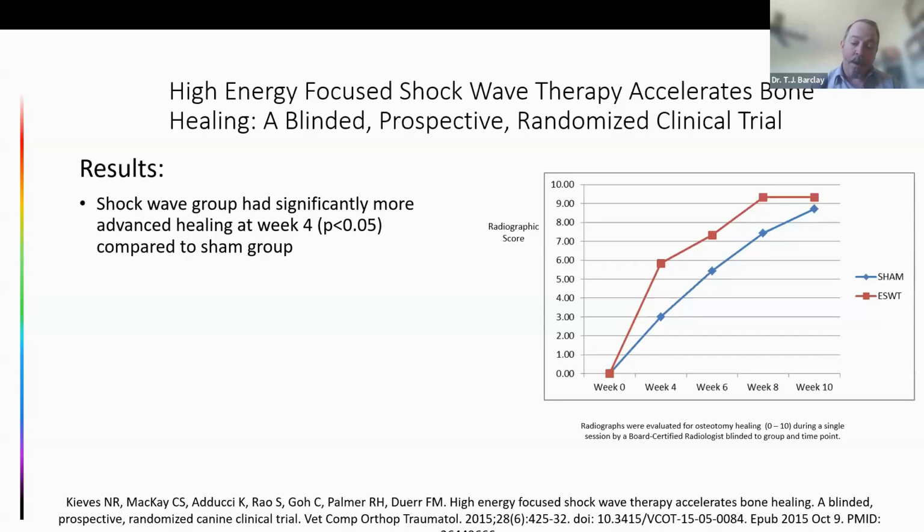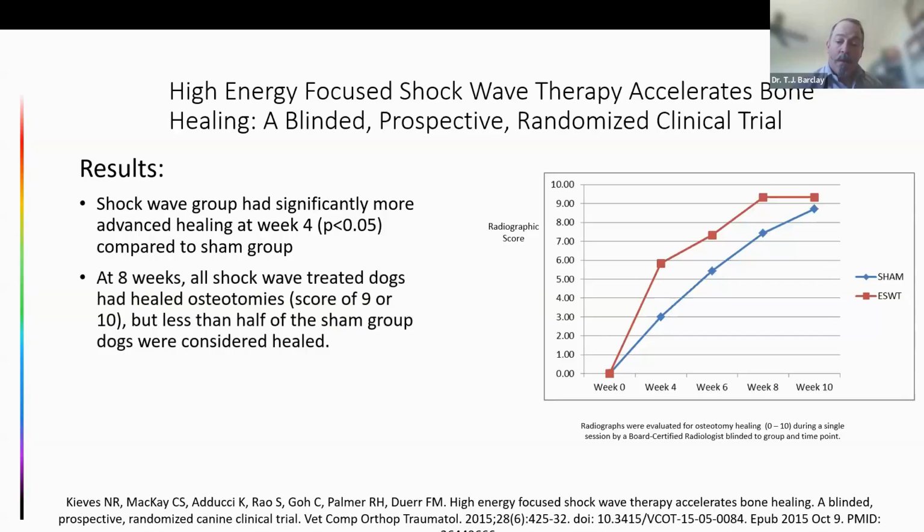So the radiographs were evaluated by a radiologist and assigned healing scores. And the radiologist was blinded to the treatment. There was significantly more healing at the 4 week interval, but the shockwave treated group was ahead of the control group at all time points.